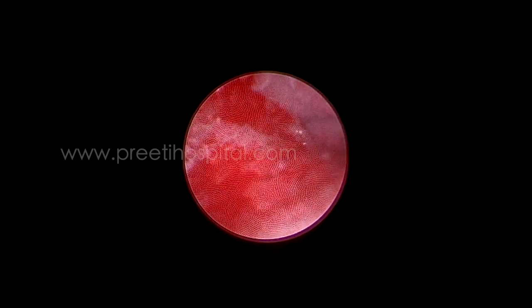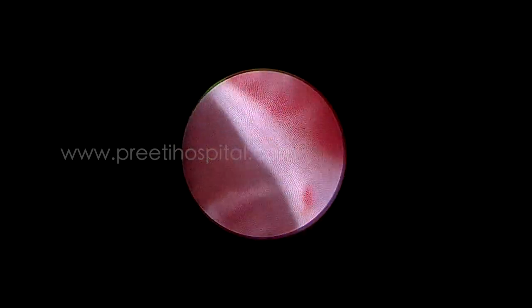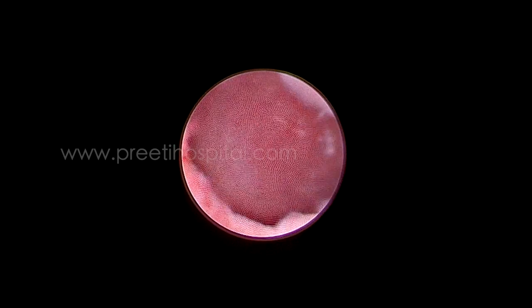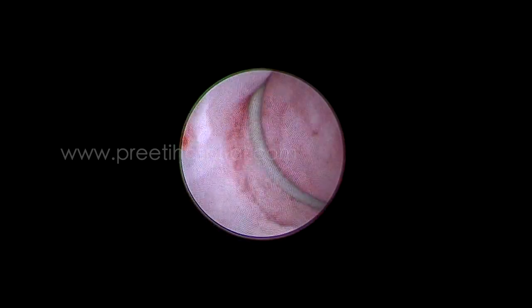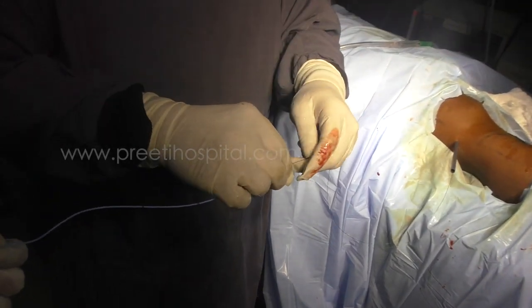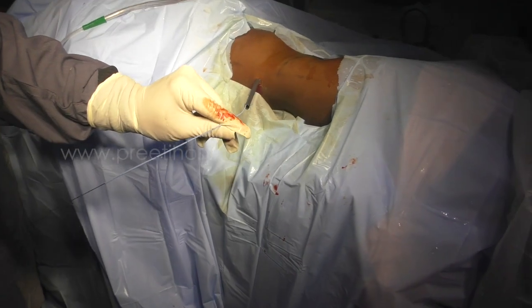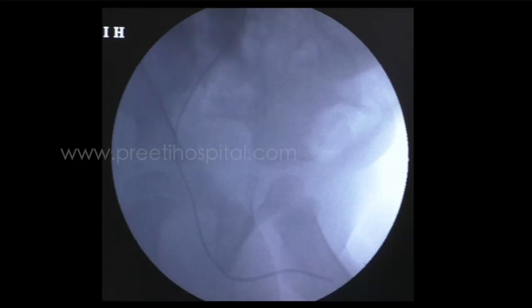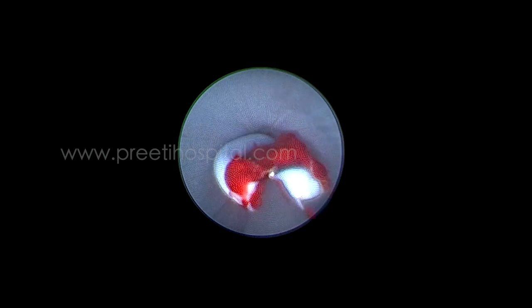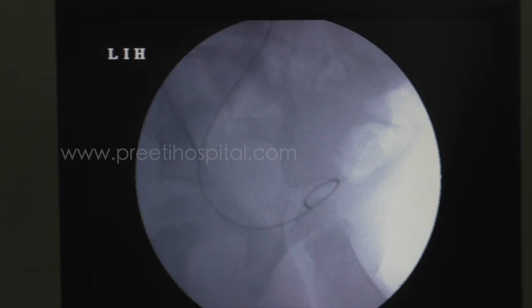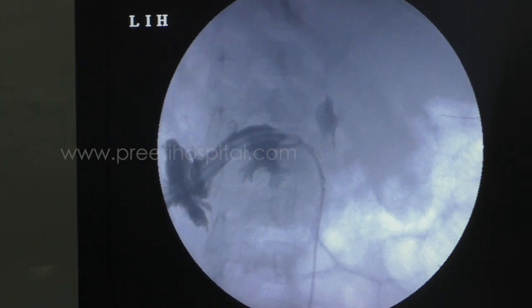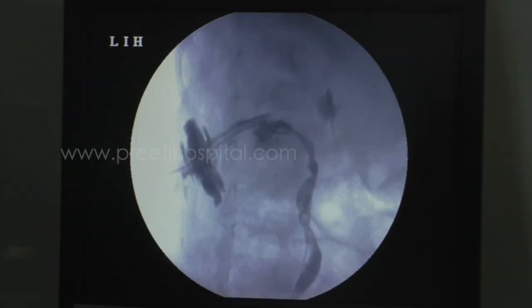The only problem occurred during dilatation at 6, 8, and 9 French. All the calyces in the supine position could be inspected in this case. The only problem was a small perforation on the medial wall, which was noticed at entry only and might have been avoided. At the end of the procedure, antegrade pyelogram showed some contrast outside the pelvis, which usually heals. A nephrostomy was kept for 2 to 3 days and then removed. The stent at 16 centimeters appeared too long, so we should go for less than that. The small contrast leak on the medial wall was not a problem postoperatively, as the rest of the collecting system was intact and the nephrostomy was in proper position.